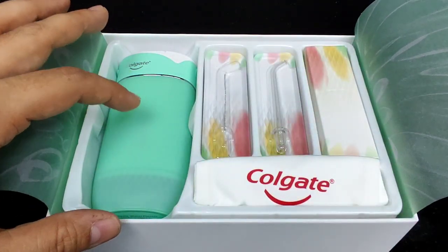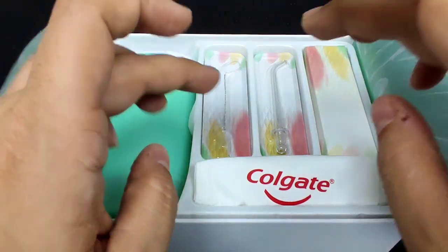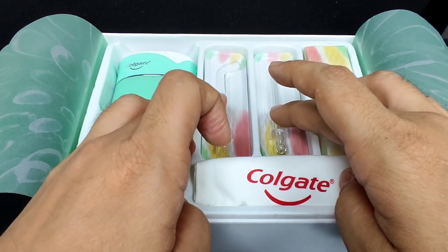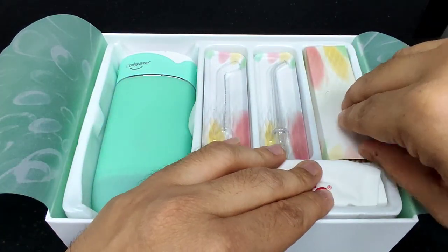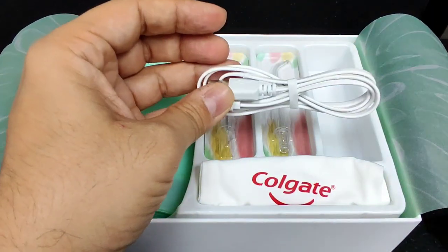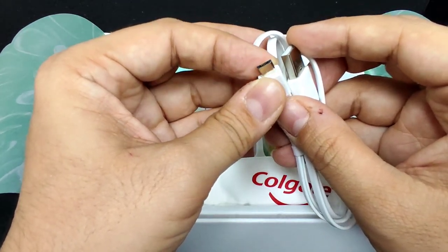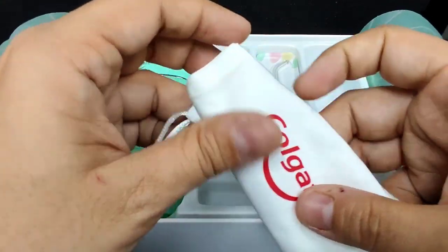This is the actual body of the water flosser, but I'll come to that a little later. You have two delivery tips — I've already removed one and I'll tell you where I've kept it. You have a USB cord charger — USB on one side and a charging slot very similar to the ones on our regular mobile phones. And you have a Colgate pouch here.